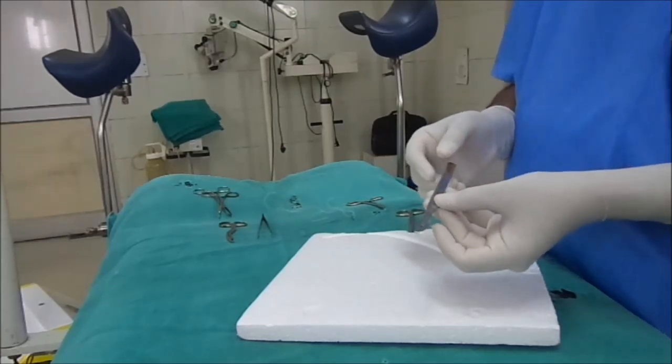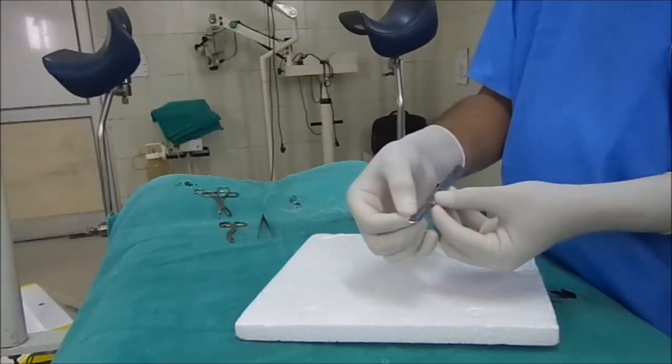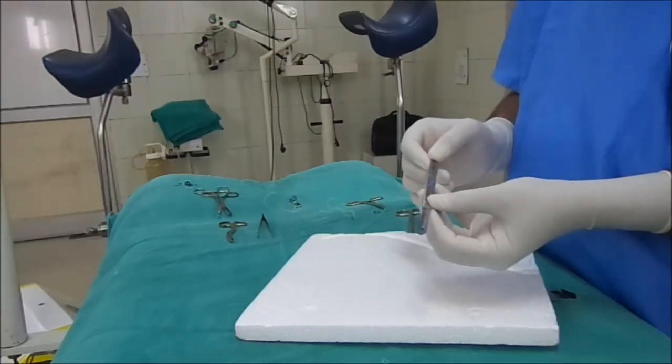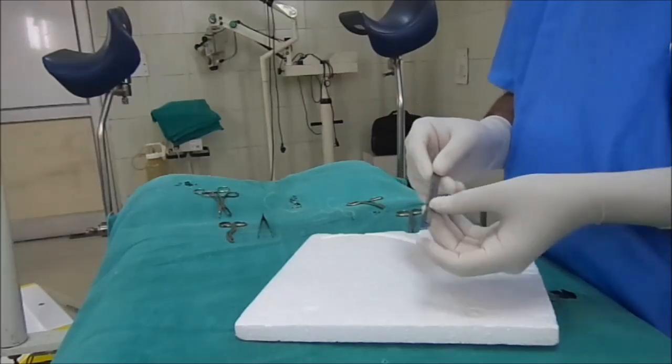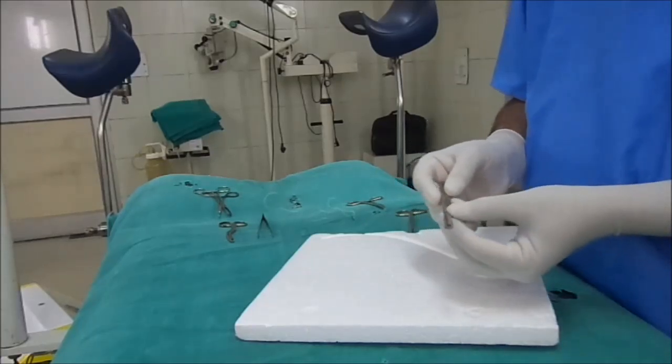The scalpel consists of two things: the first is the surgical blade and the second is the BP handle. This is a number four BP handle and it can accommodate blades of numbers 20, 21, 22, 23, and 24.